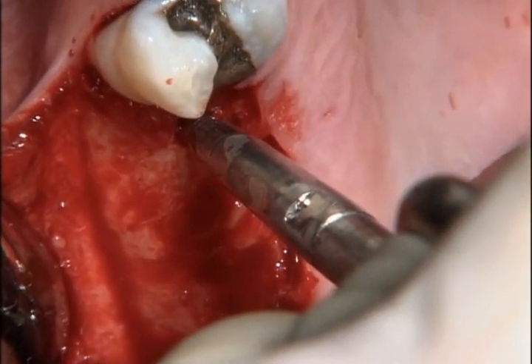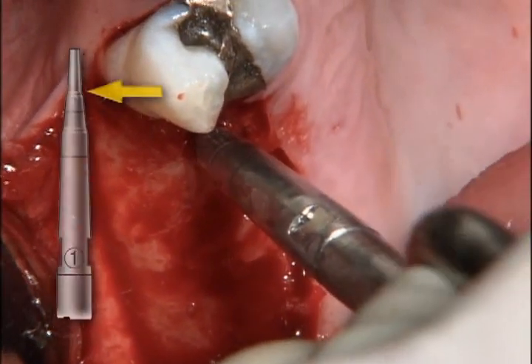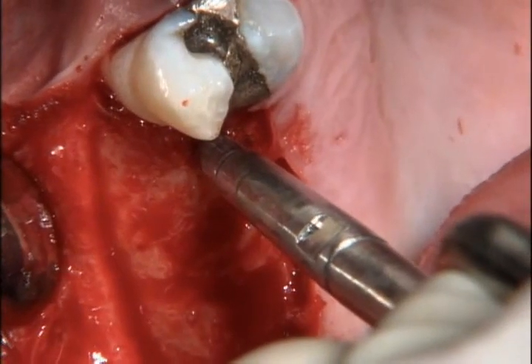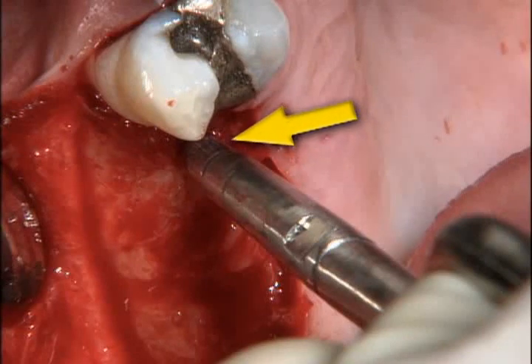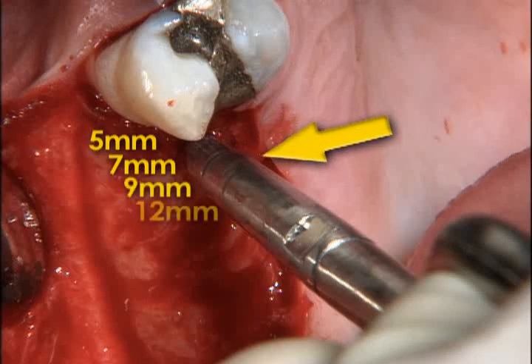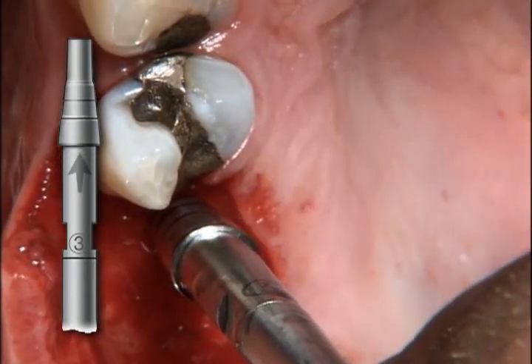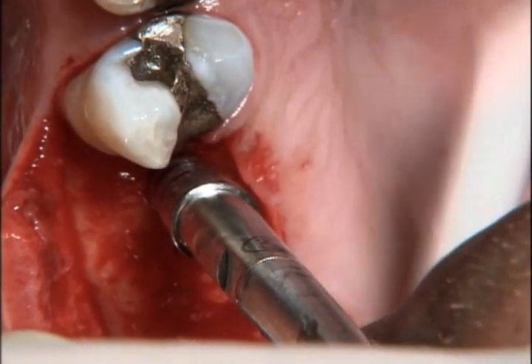Since there was approximately 6 millimeters of existing subantral bone at the second premolar site, the number 1 osteotome tip was seated only to a depth of 5 millimeters, using the appropriate mark on the osteotome handle as a guide. The markings on the osteotome tips correspond to depths of 5, 7, 9, and 12 millimeters. The number 2 and number 3 osteotome tips were then used in sequence to widen the osteotomy to the same depth of 5 millimeters.